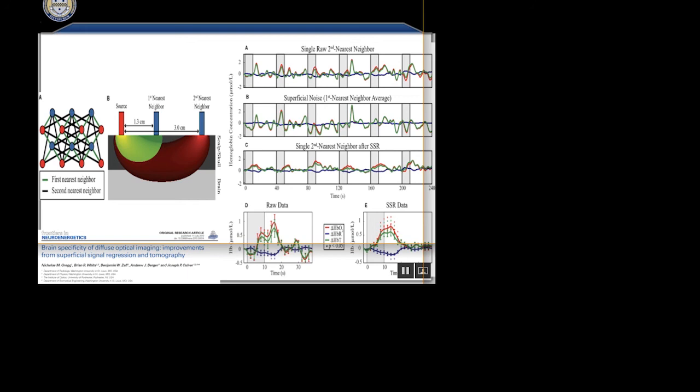Something particularly innovative that we did is all of these are connected to a single detector because we multiplex. You're only sacrificing one detector to get 8 different short channels, so you don't have to have 8 different detectors to get 8 short channels.